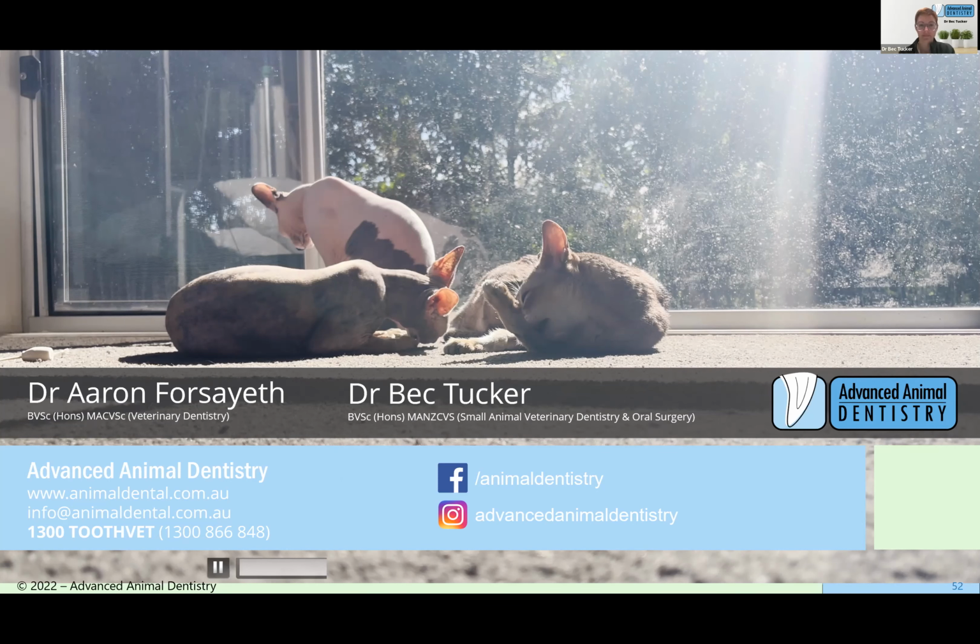And Donna's got a question here about perspex protectors. Again, no, we don't use them. I don't see a massive value in them. I will bend a plate from time to time accidentally, and I have marked a couple because I've done it. But I think it could definitely be beneficial in getting it to sit in and not bend or flip around as much when you're trying to get it to sit in that rostral oral cavity between the canine teeth. I think that'd be a definite benefit there. But imaging more caudally, I think the bulk of it starts to make it more difficult to get the plate far enough back. I guess it can help you identify your angles, one side of your big angle. Yeah.